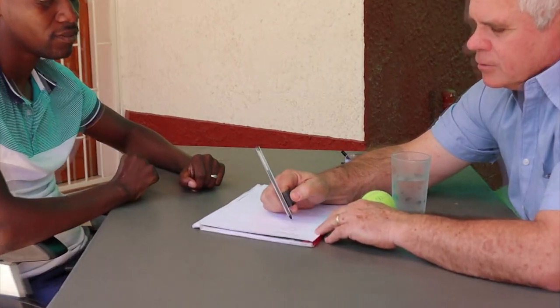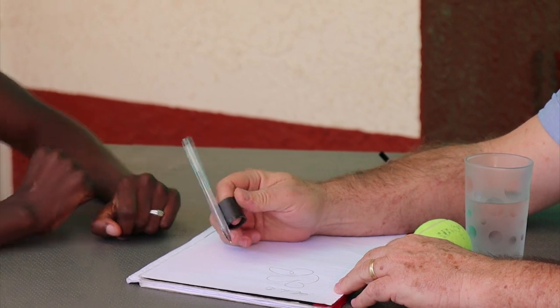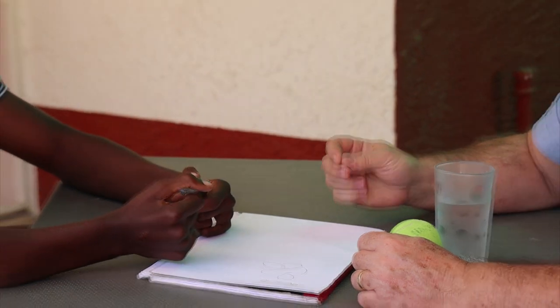With this one, if you don't have a grip, you can put it on your finger and write with it like this. You can easily sign your name or draw a picture. It's easier than taking the pen in your hand. So this is again for people with limited hand control.